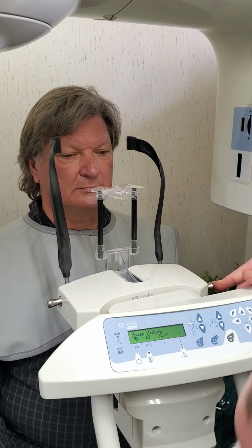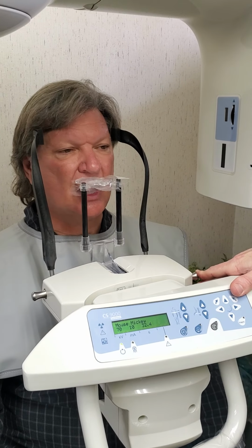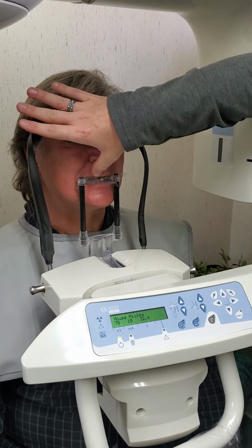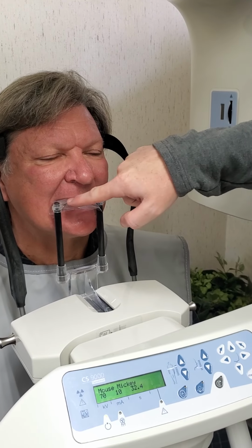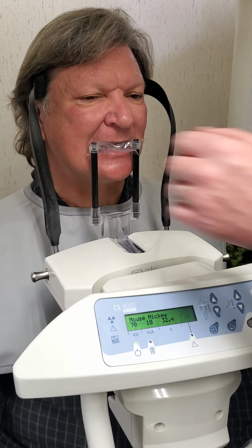And at the same time, we'll have the patient scoot forward into the machine, bite right on the plate, and you want their top teeth to be locked right on the edge of that little rim that's on there. Okay?